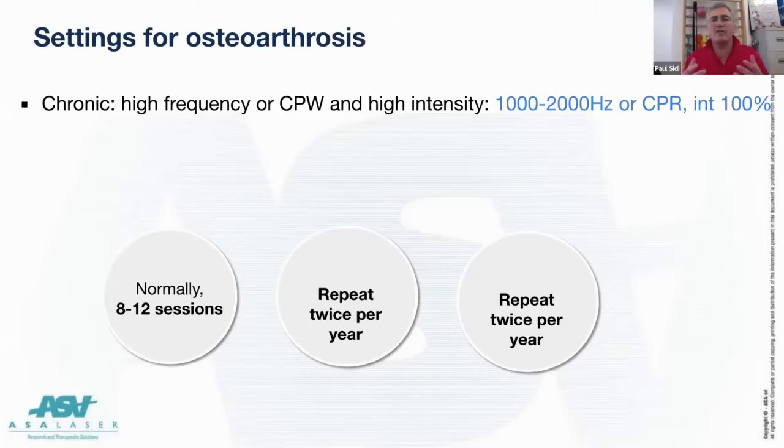What I like to look at is the 3-2-1. If you can, with a patient who's got the problem, 3 times the first week, twice the second week, once the third week. I give my swing analogy. You push a kid on the swing, goes flying high. If you leave it 7 times, it'll come back virtually to a standstill. This machine is cumulative. It really works on top of itself. So you give the kid a swing, and every 2 or 3 swings, you give it a little push, and the kid is still flying high, and he thinks he's going over the top, and he's panicking like mad. That's what's happening. So 3, 2, 1.